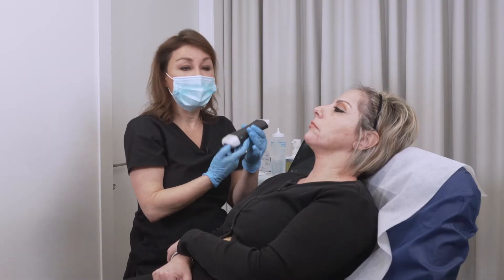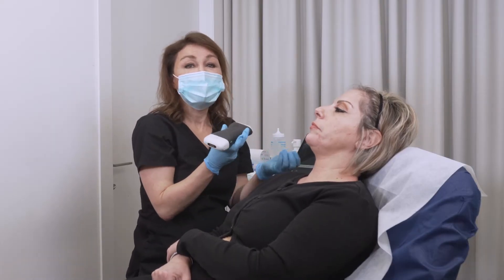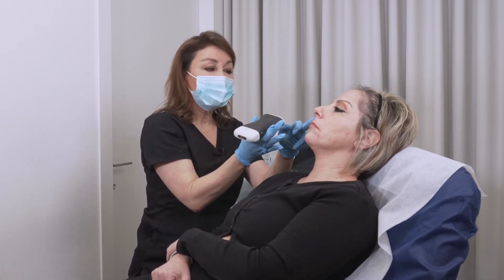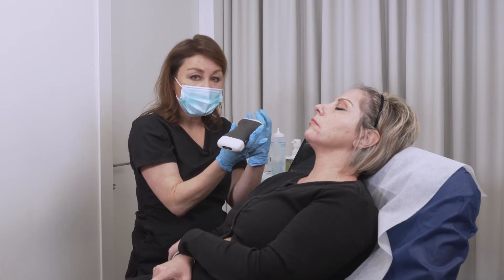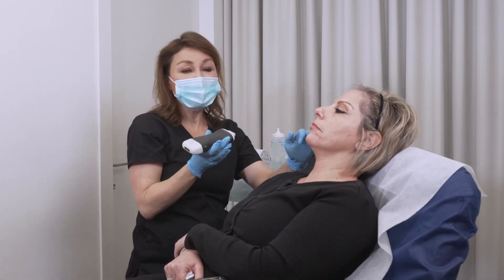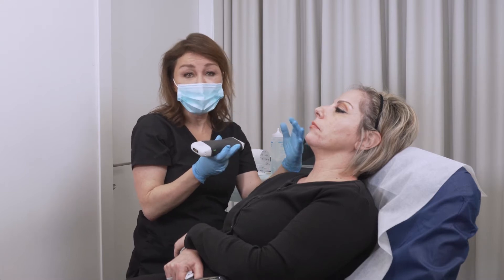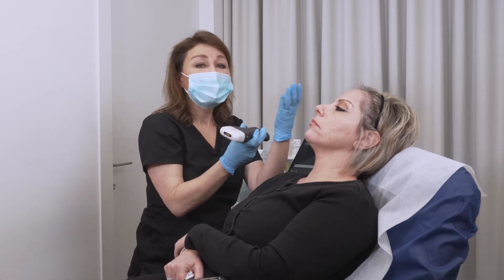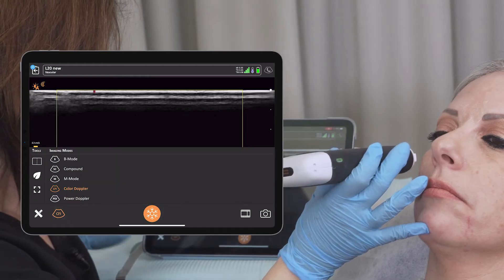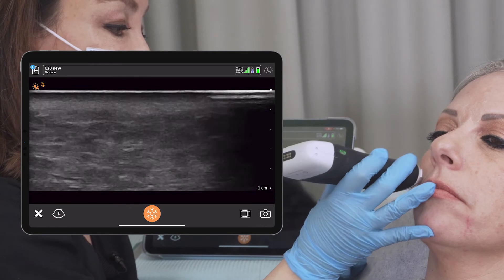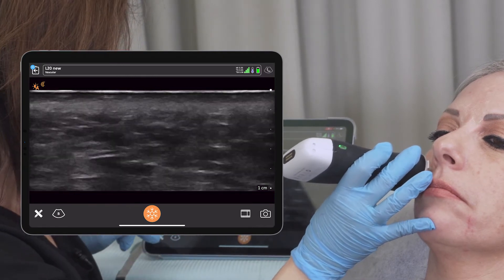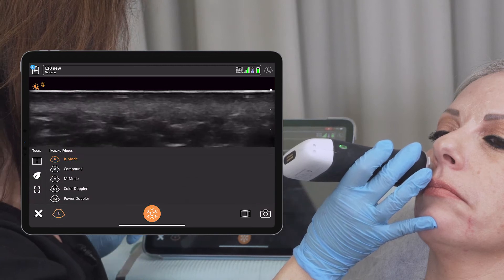Where we do have a bigger vessel is the infraorbital artery, and the infraorbital artery exits from the infraorbital foramen. This vessel we need to map when we want to inject the medial and the front of the cheek. So here, we can check for the vessel, and I'm doing the color Doppler.